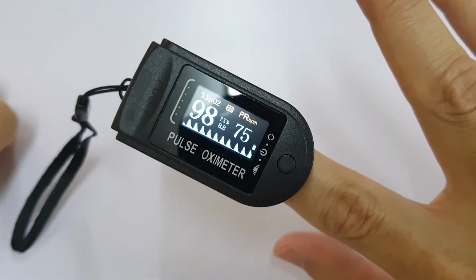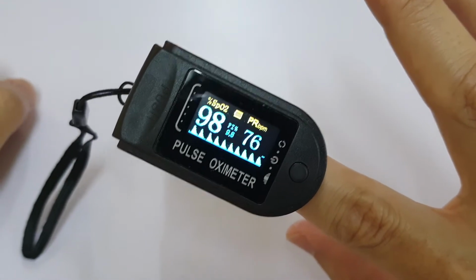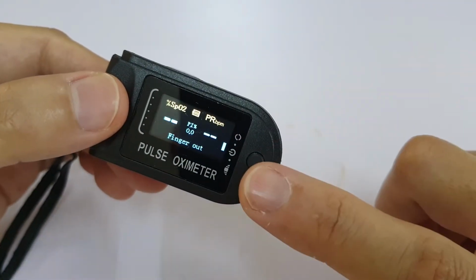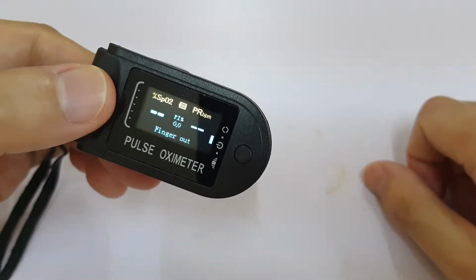This one will continuously monitor, although it's not designed to be 24 hours. It's just for testing purposes. And if you take it off, once it doesn't detect a finger, it will turn off by itself. As long as your finger is inside, it will continue to work.